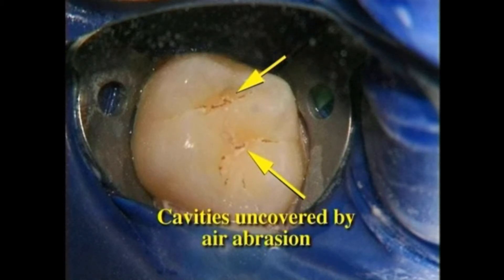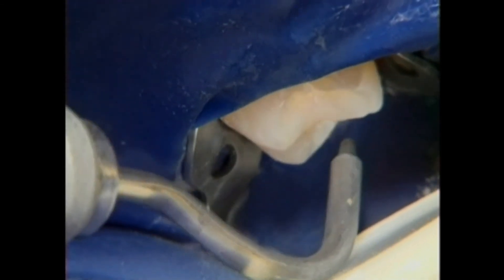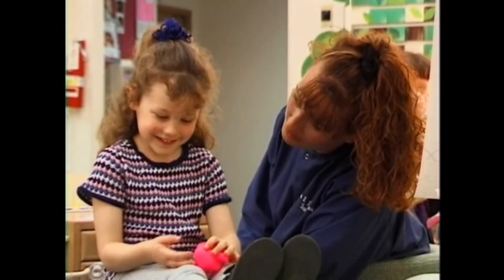Now you know why we may have to delay the final diagnosis of cavities in back teeth — because the stains in back teeth require investigation with air abrasion before an accurate diagnosis can be made. Air abrasion is a wonderful new tool in dentistry that helps us provide the most accurate diagnosis and the most comfortable treatment for cavities on the biting surfaces of back teeth.